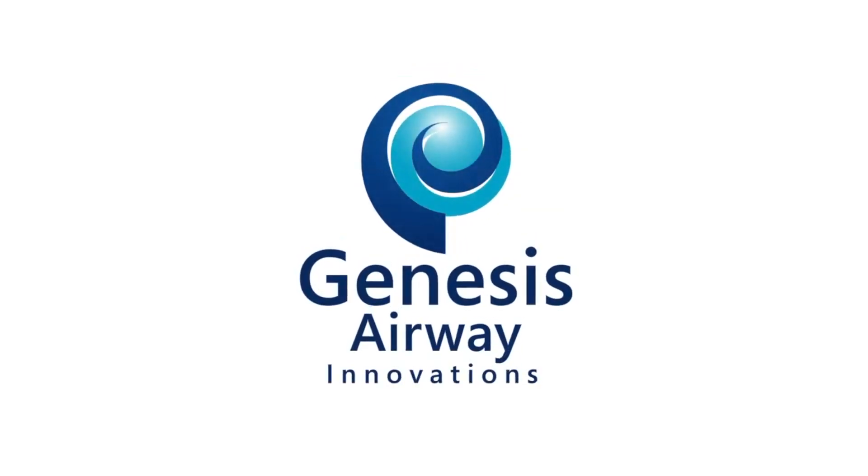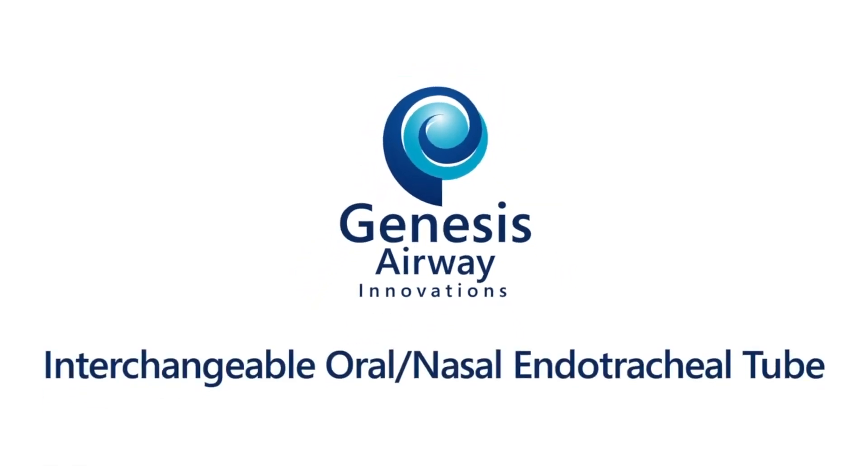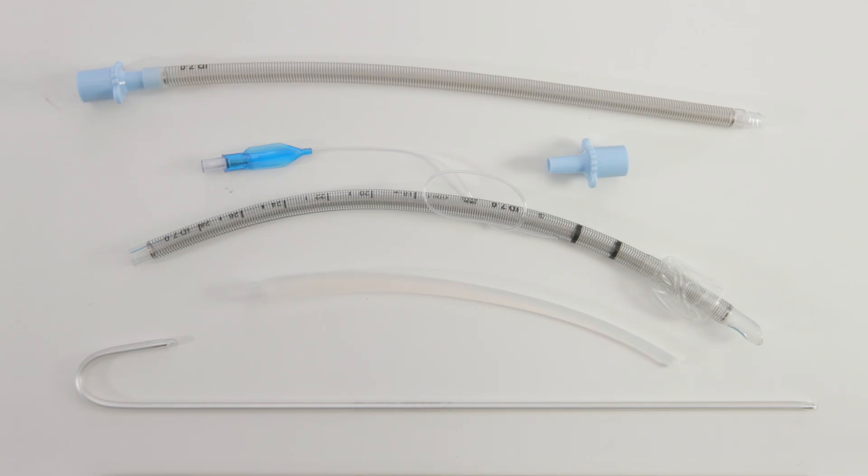In this video, we will be demonstrating the use of the Genesis Interchangeable Oro-Nasal Endotracheal Tube. This kit contains a flexible reinforced endotracheal tube with a posterior facing bevel, modified cuff inflation line insertion, and a removable 15mm ISO connector.